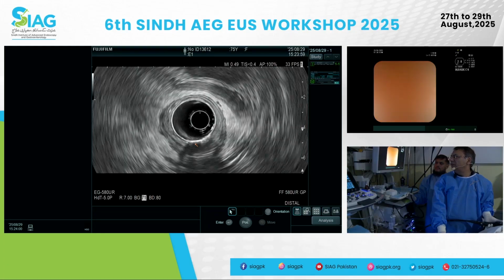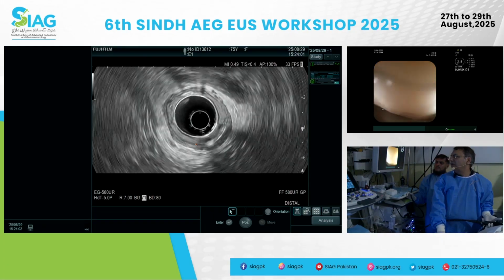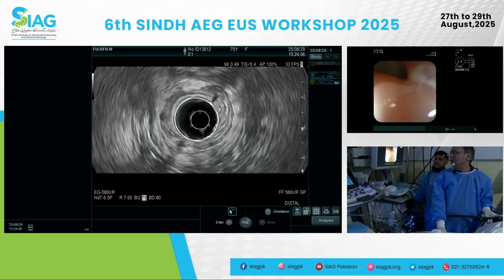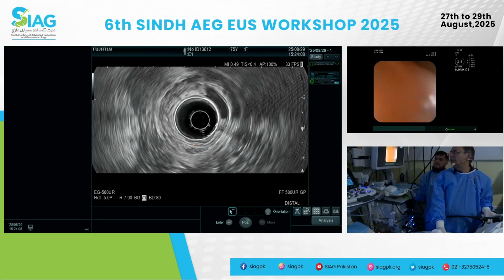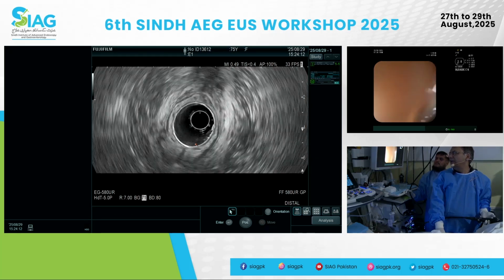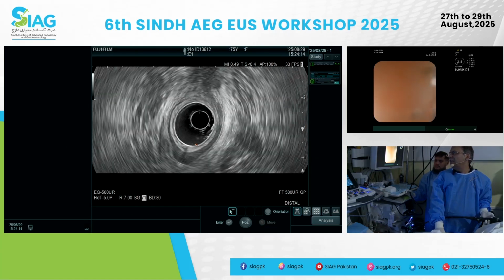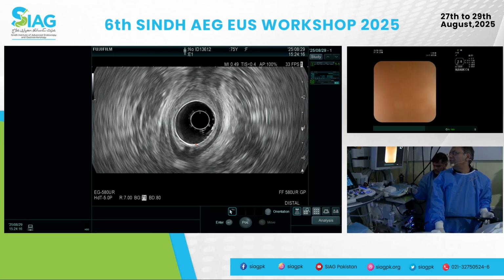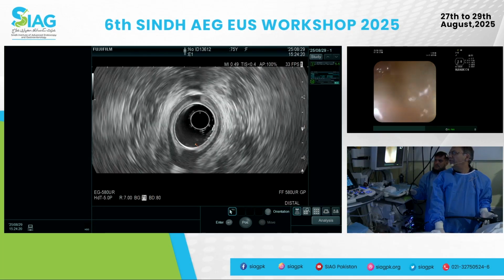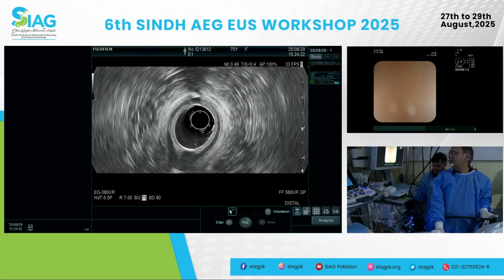We'll go to the sphincters now, internal and external sphincter. For the internal sphincter, you basically follow the muscularis propria downwards towards the anal canal. You see it becomes a little bit thickened as soon as you get closer to the anal canal. It's all very nicely intact.